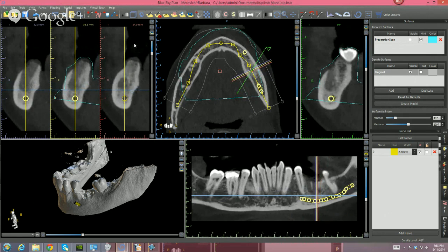Now imagine you're doing it guided, so your drill is being held in place as you go down. But remember that the implant is larger than the hole in the bone, so when you hit this area, the implant could be deflected towards the lingual. That's number one. Number two, you might have it guided in the proper position, but who says that the doctor will be able to actually perform the cutting away of bone that's this dense?